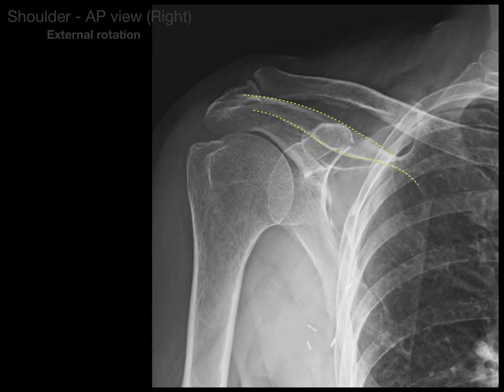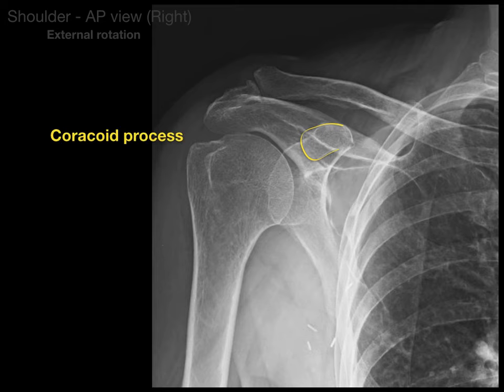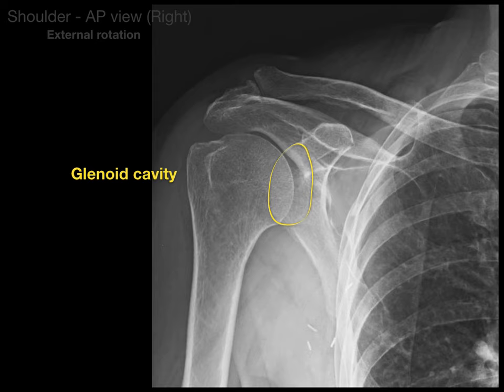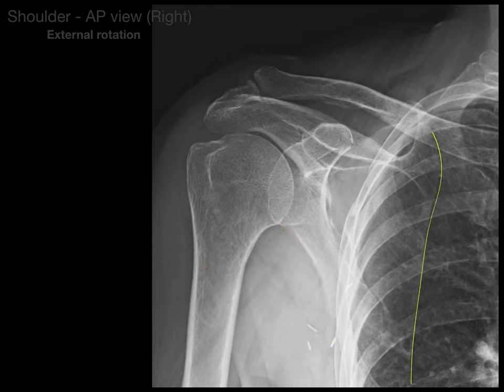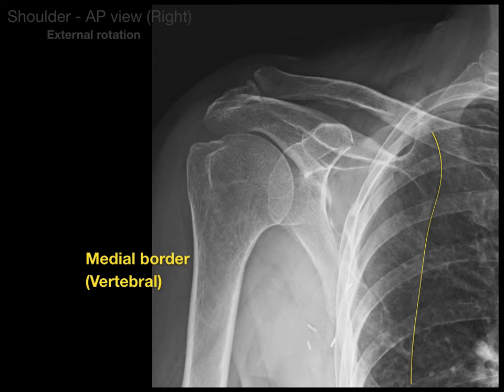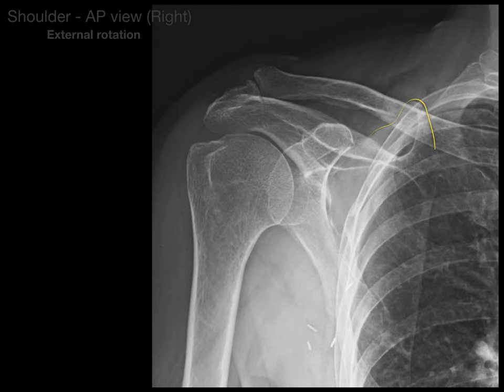That prominent structure is the spine of the scapula — a very prominent surface landmark on the back of the shoulder blade. Anatomists noted it looked like the beak of a crow, so they called it the coracoid process, which serves for muscle attachments. Then we see the glenoid cavity, also known as the glenoid fossa, which forms the socket of the ball and socket joint of the shoulder. We also see the lateral border of the scapula, also called the axillary border, and the medial border, also called the vertebral border. At the very top is the superior angle of the scapula, where levator scapulae attaches.